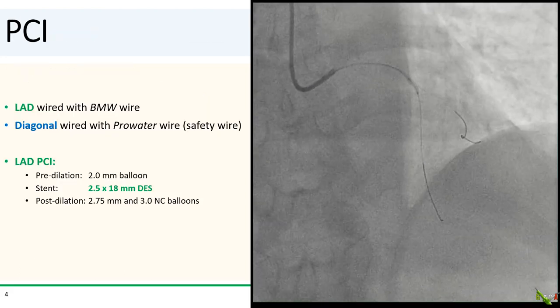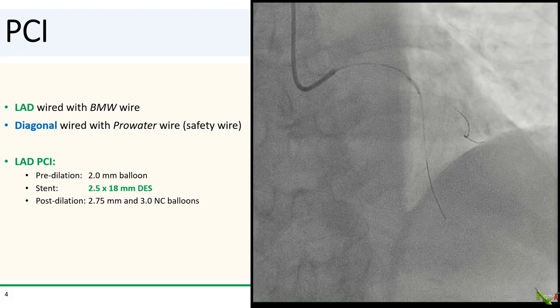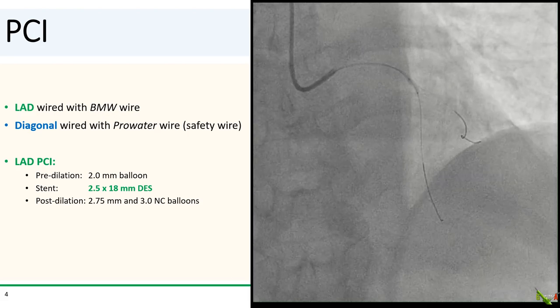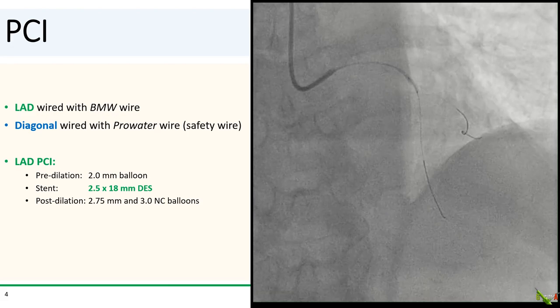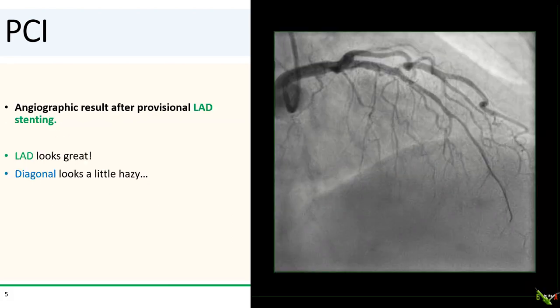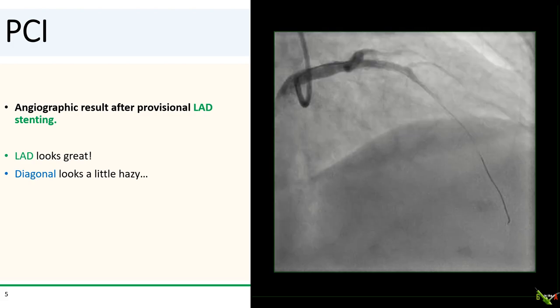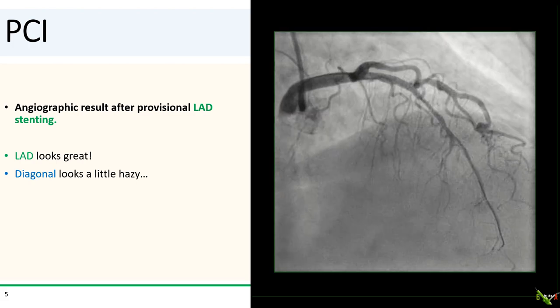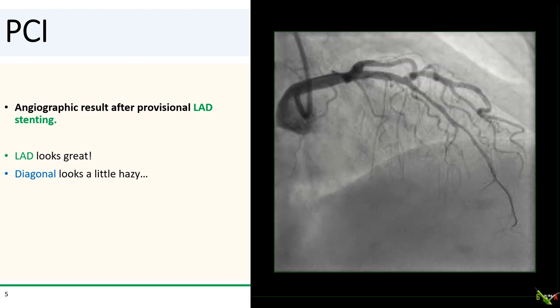We wired the LAD and diagonal fairly easily with workhorse wires. We pre-dilated the LAD with a 2.0 millimeter balloon, stented it with a 2.5 by 18 millimeter DES, and post-dilated with 2.75 and 3.0 millimeter NC balloons. Here is the result after provisional stenting — the LAD looks great, and the diagonal was patent, but does look a little bit hazy in this view.